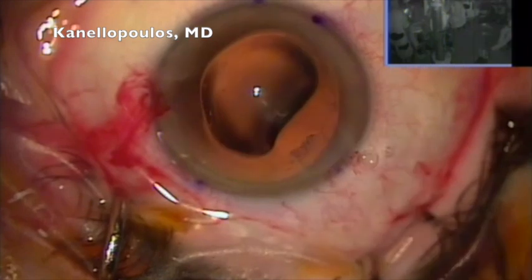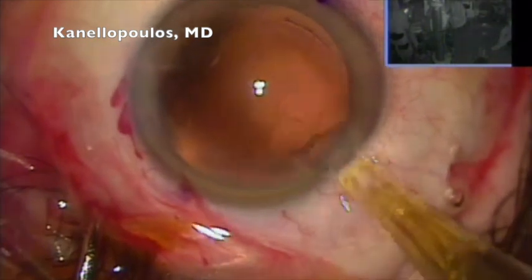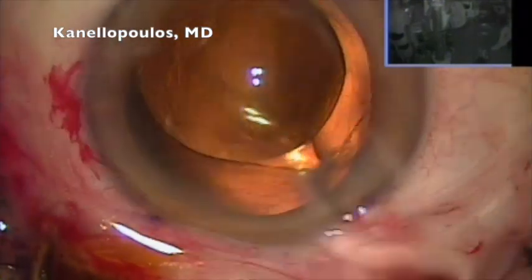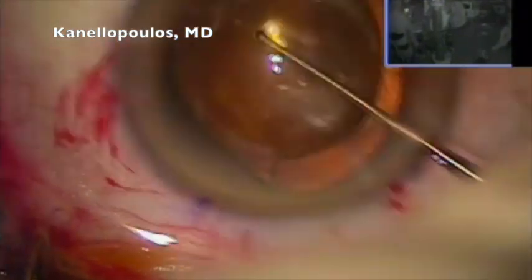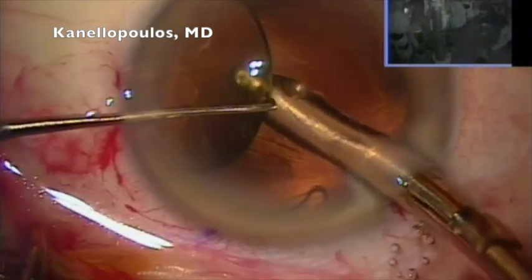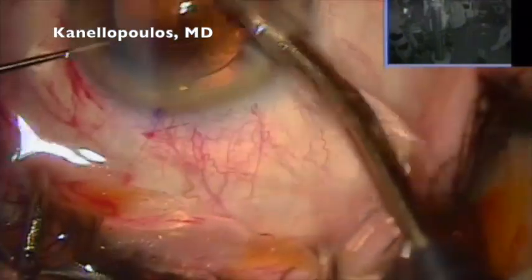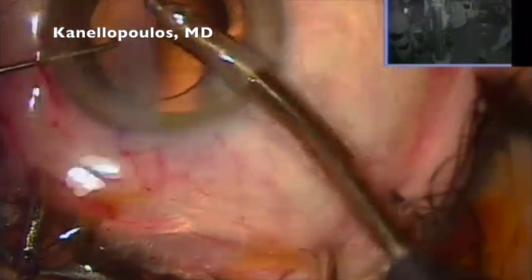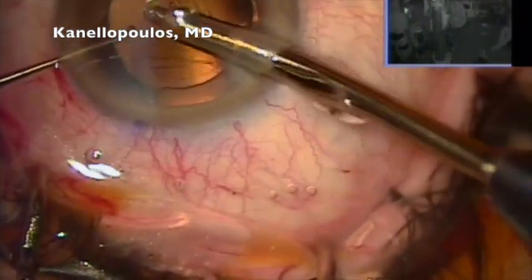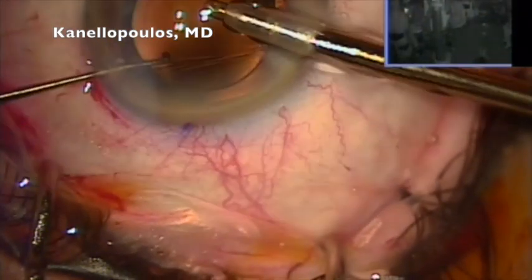I noted at the meeting in Rio de Janeiro, which was probably one of the best I've been, the Brazilian Association for Cataract Refractive Surgeons, that blended vision in our hands aims for a minus 0.2 in the dominant eye. Here, it is very important to remove the viscoelastic from under the lens, being very careful not to grab the capsule. This helps a lot with effective lens position, because if there's a pocket of viscoelastic behind the lens, that may change the position and all the calculations. Meticulous removal of viscoelastic, and then go in and place our lens at the markings.